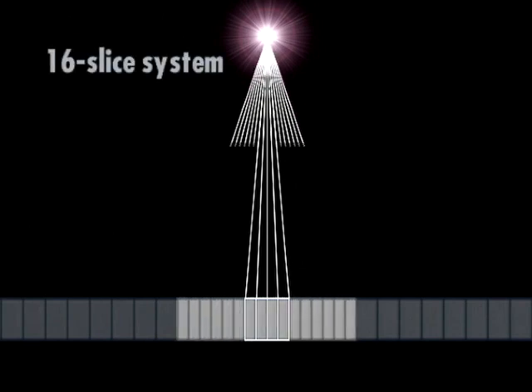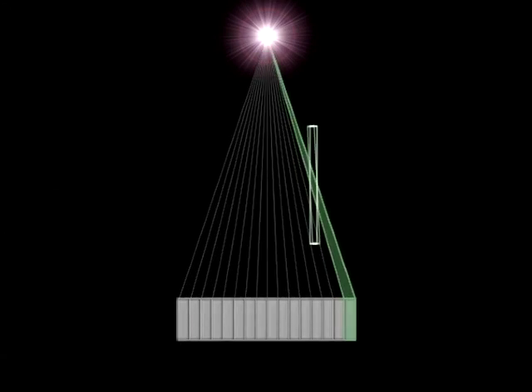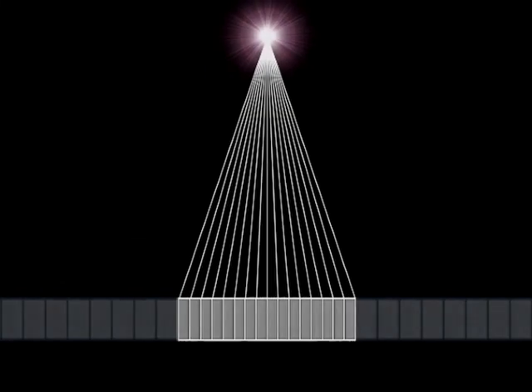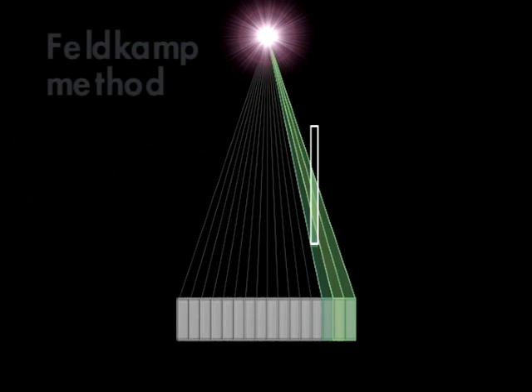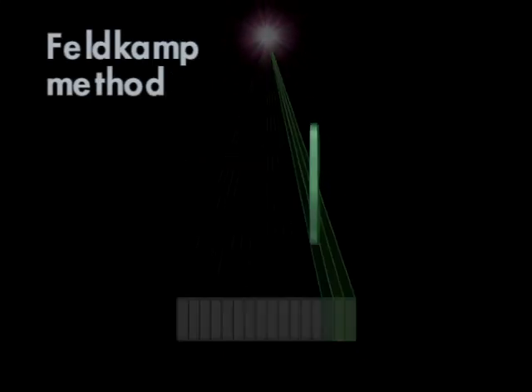With 16-row scanning, however, artifacts related to the cone angle multiply in number near the edges of the field of view. Attempting to reconstruct cone-angled data as data coming from directly above, as in the conventional method, will yield poor results. TOSHIBA has therefore employed the Feldkamp method, a reconstruction method said to require the highest computational power.